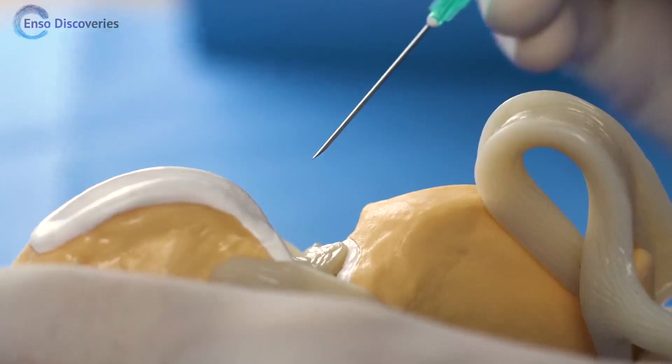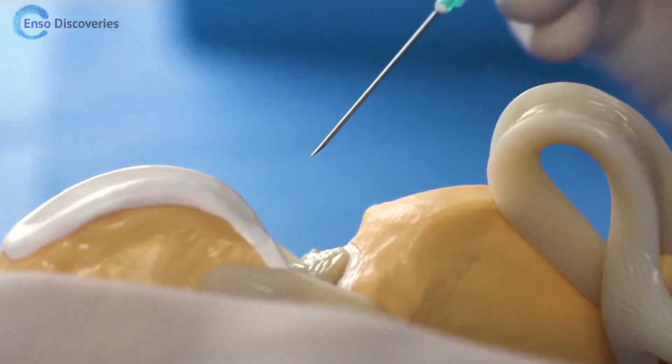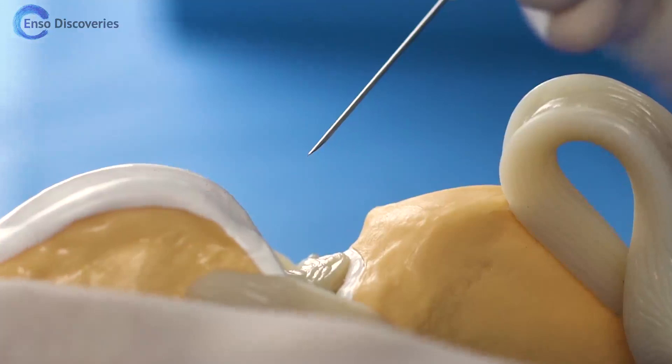To recap, this time from the side with the patellar tendon removed: your injection site is halfway between the tip of the patella and the tibial tuberosity, just to one side of the patellar tendon.